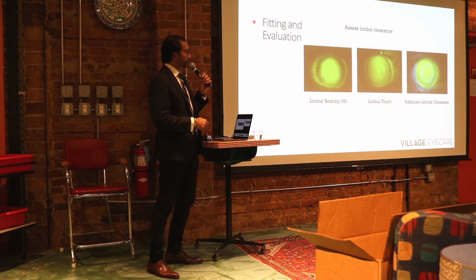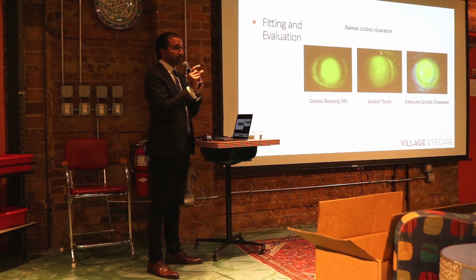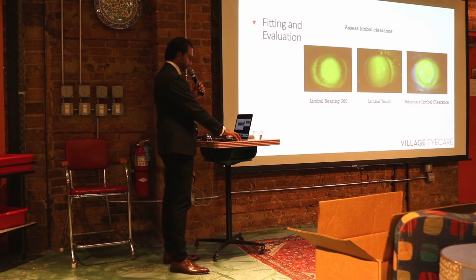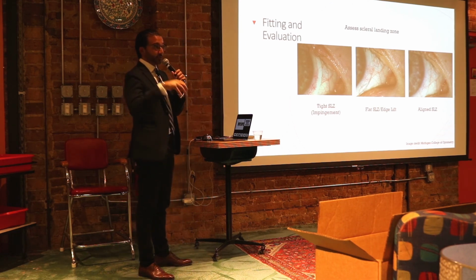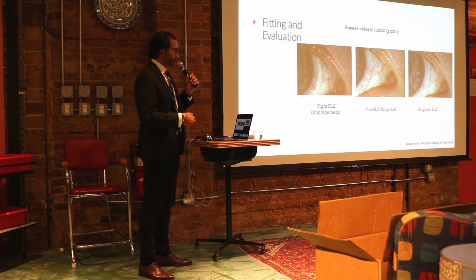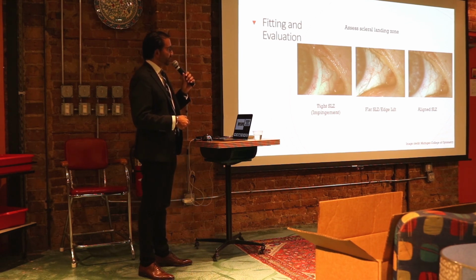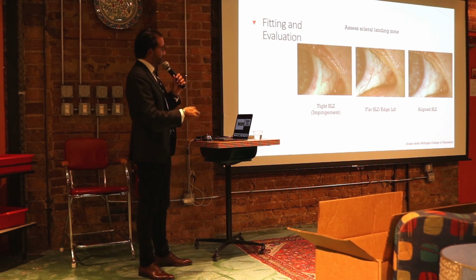There are a number of different ways to increase limbal clearance. One, opening the optical zone. You make the diameter bigger, but we have to clear the limbus. Let's go to the edge. Again, you can't have a lens that's landing too steeply or too tight. In this case here, the edge of the lens is diving into the sclera and causing impingement. Obviously, over time, this lens will feel tight, cause a lot of hyperemia, and would need to be adjusted. Typically, you're going to flatten the edge of the lens, lifting it up off the sclera.